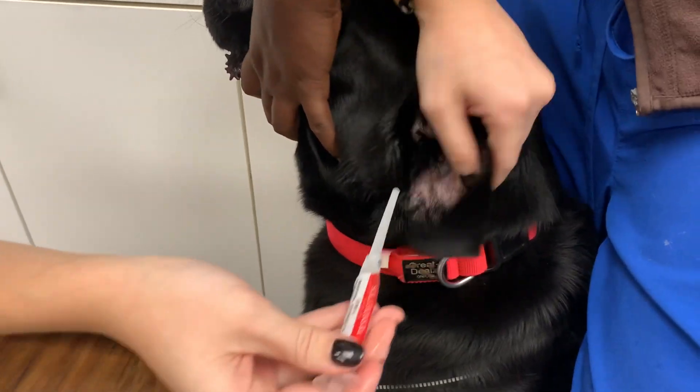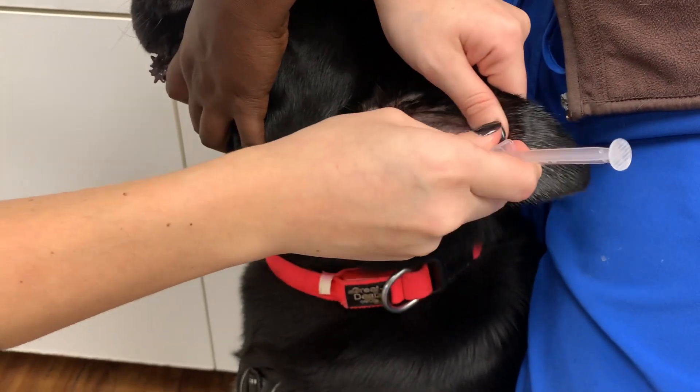I've pre-warmed an otopak, which I'm going to place deep into the ear canal.